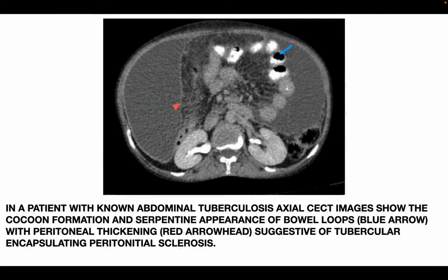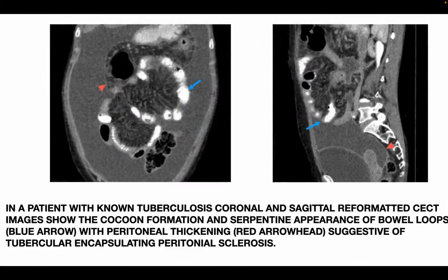This is another case of a patient with known abdominal TB. Axial CT image shows cocoon formation and serpentine appearance of the bowel loops (blue arrow), with peritoneal thickening (red arrowhead), suggestive of tubercular encapsulating peritoneal sclerosis. Coronal and sagittal reformatted images of the same patient confirm the cocoon formation with peritoneal thickening.